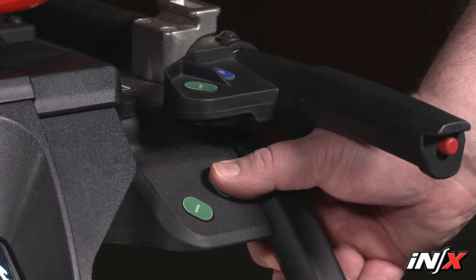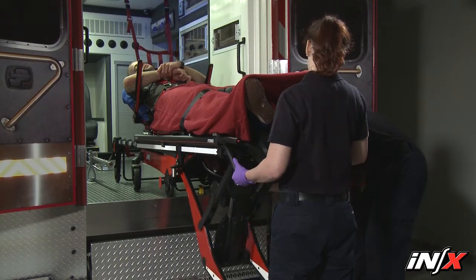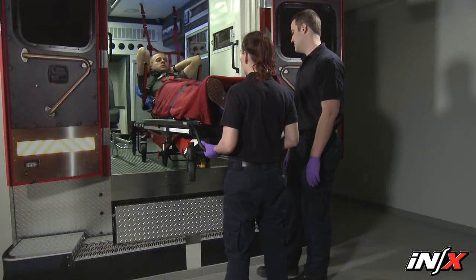Press the plus extend button to extend the control end legs. Stop pressing when the legs are supporting the load. Ask the load end operator to disengage the intermediate safety bar from the safety hook. Keep the NX parallel with the ambulance sidewalls while you pull it out of the ambulance.